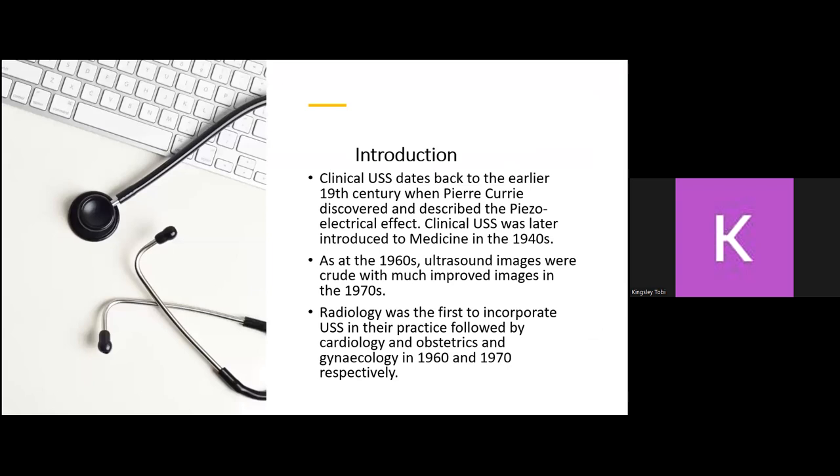By way of introduction, clinical ultrasound is as old as the 19th century, when the activities of piezoelectric crystals were first recognized. Clinical ultrasound was later introduced to medicine in the 1940s.